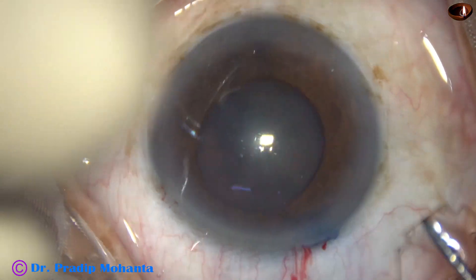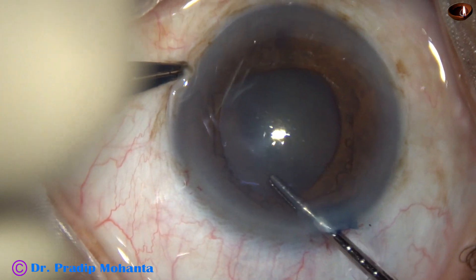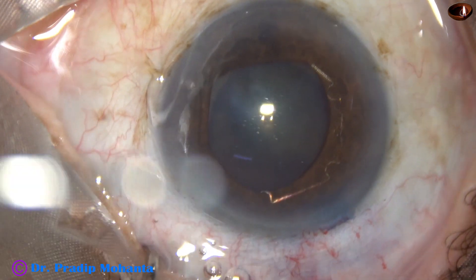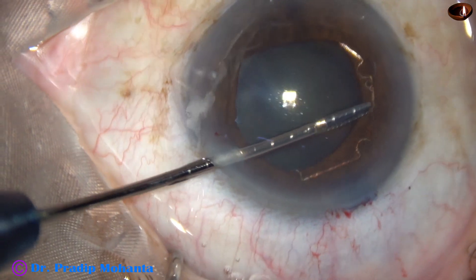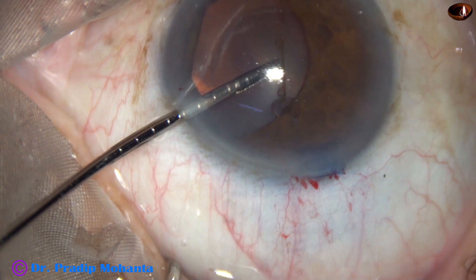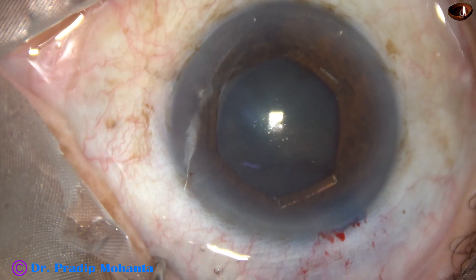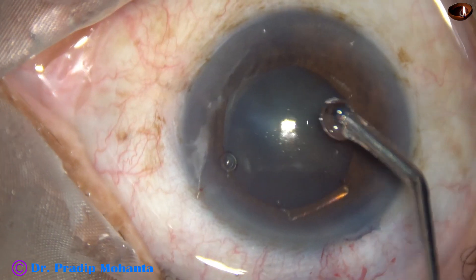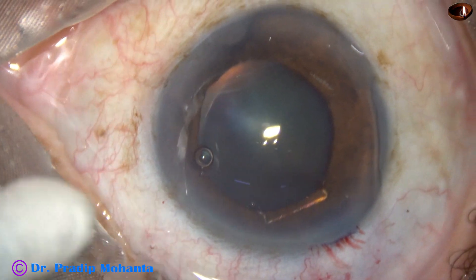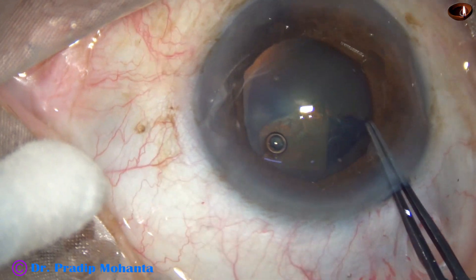This is a very thin uniplanar device. You don't need any injector system to apply and remove this device. It is so flexible that it can go through a 2 mm incision or even less than that. Some amount of viscoelastic substance is applied over the cornea. Now visibility is good. The anterior capsule is stained with trypan blue dye, and now we can do a nice rhexis.